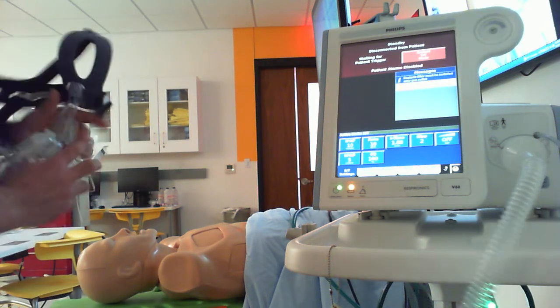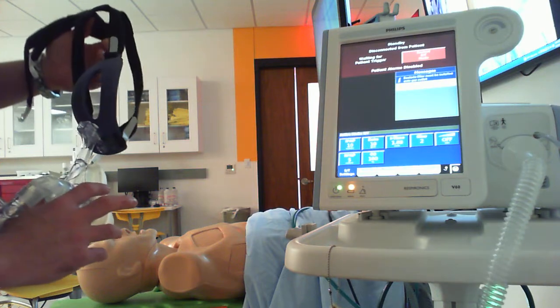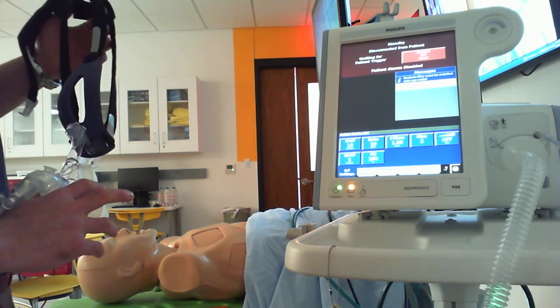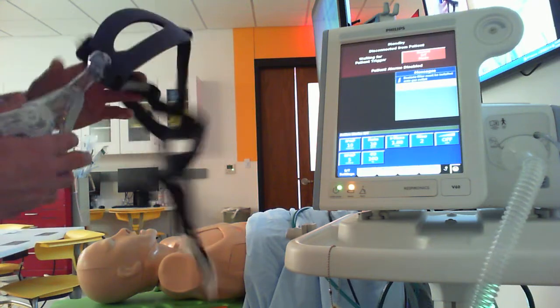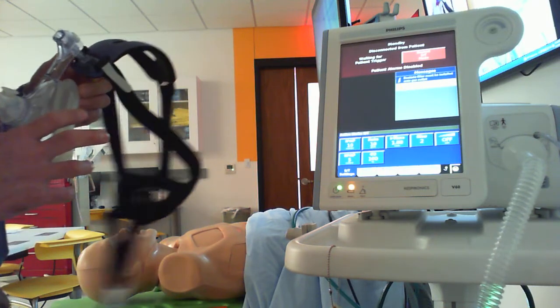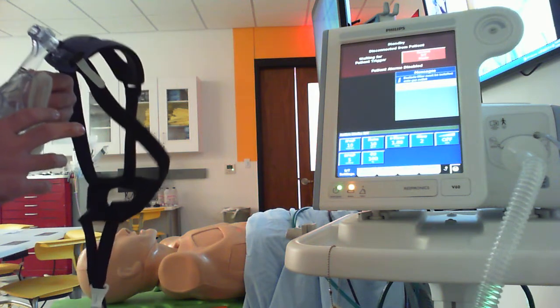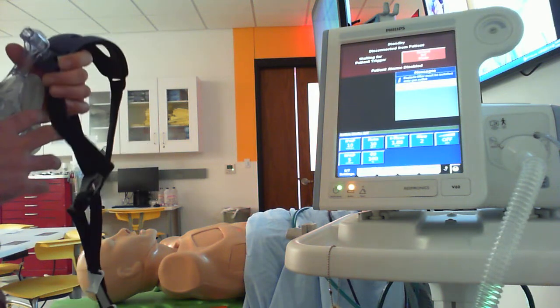All right, buddy, so Blake from Respiratory, I'm going to go ahead. You're having some trouble breathing here. We're going to try and get you a little bit more comfortable, get you breathing a little bit better. I have something called BiPAP. It's a tighter fitting mask. It's going to help force air into and out of your lungs, okay? It's going to help you feel a little bit more comfortable, hopefully. It is a tighter fitting mask, all right?